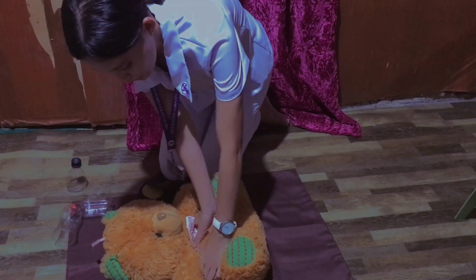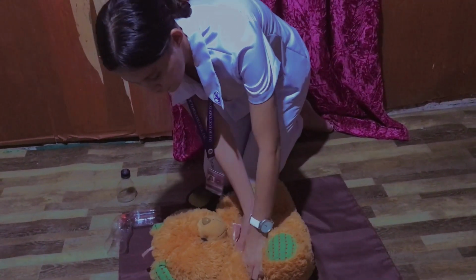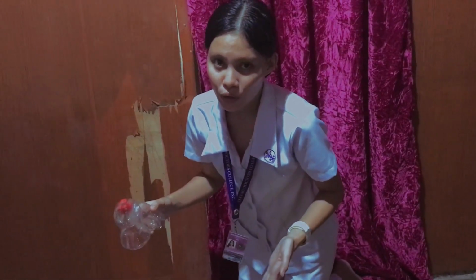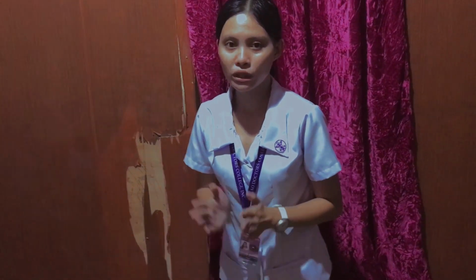1, 2, 3, 4, 5, 6, 7, 8, 9, 10, 11, 12, 13, 14, 15. And then we're going to use the bag mask to give the 2 rescue breaths. 1, 2. And then we're going to do that in 2 cycles. Each cycle should contain 2 rescue breaths. After the 2 cycles, we're going to switch roles again, and then the second rescuer will do the chest compression.